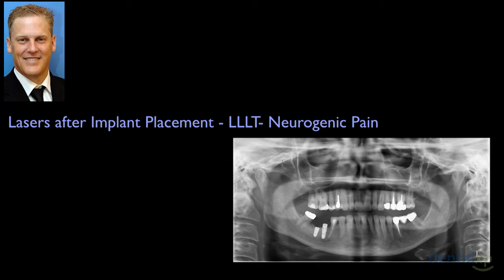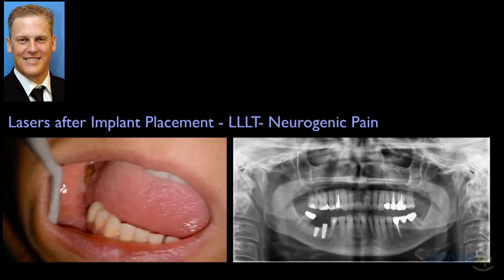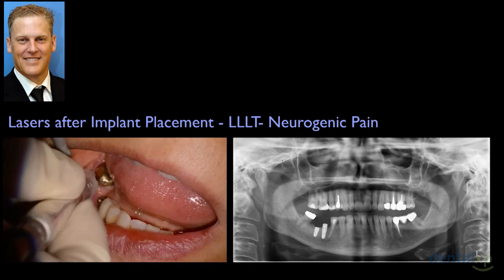2 implants were placed. This patient came back after 6 weeks and said, "I'm still numb." At this point, she was very upset. She's a psychiatrist, and she was very upset and said, "I'm not sure that I want the implants to stay in there. I want them out." So we were able to take the diode laser over without a tip, just with a barrier over top. And for 2 minutes of time, every 2 days, for the next 3 weeks, we used the laser.